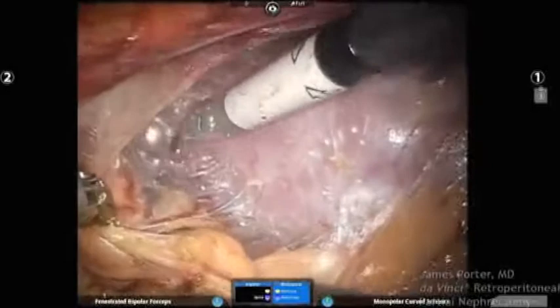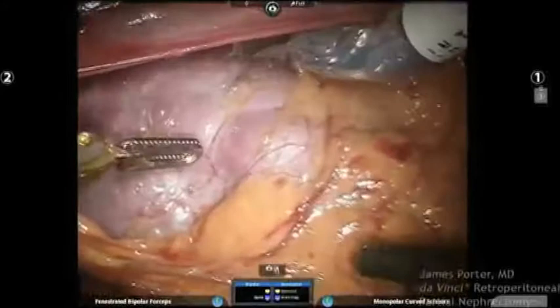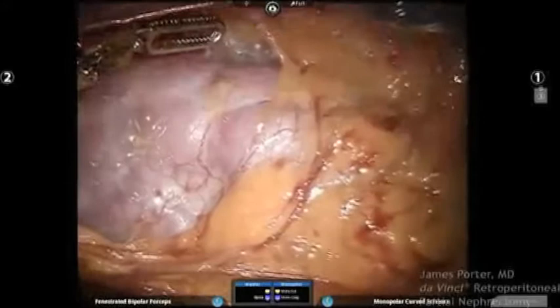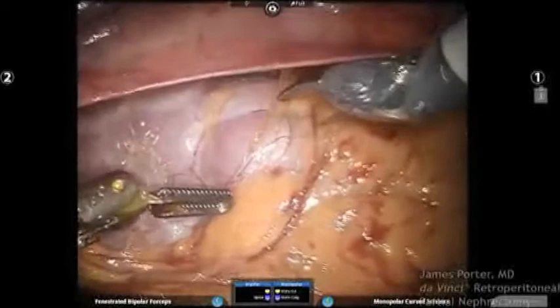You know, it's easy to get disoriented sometimes, but for example, right now, if I didn't know where I was, I'd put ultrasound right on the kidney and we could localize the tumor. Let's do that anyway, Nance. Let's get ultrasound ready. You could put ultrasound on the kidney right now and start looking for the tumor before you even start your dissection to guide your dissection, and I do that in certain cases. I have a pretty good idea where this tumor is. It's going to be right up here, but we're going to put ultrasound on and just show you that. I think it's a really nice guide.